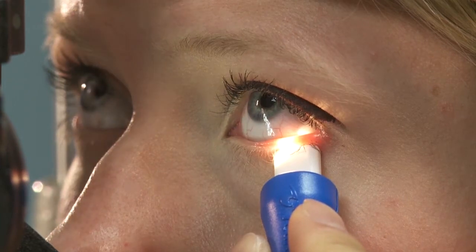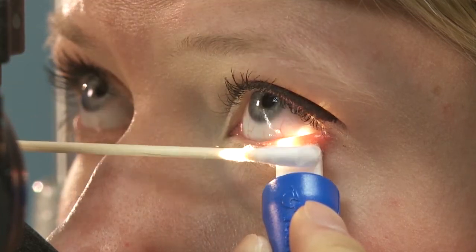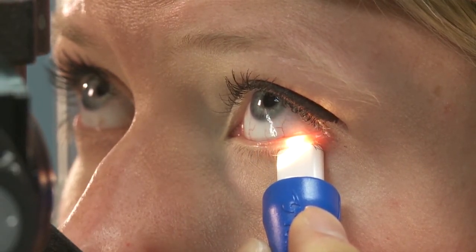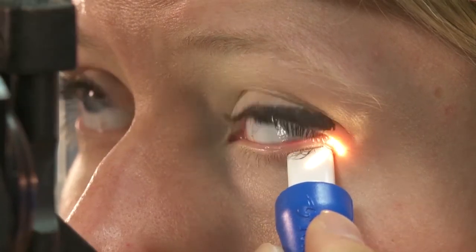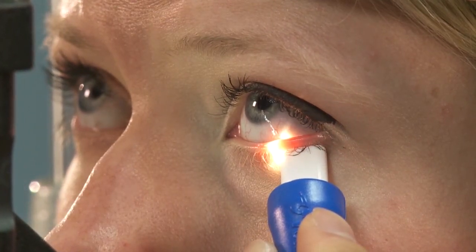Adjust the position of the MGE to roll the lower eyelid margin slightly outward for a clear view of the Meibomian gland orifices. To facilitate observation of the gland secretions, gently wipe the eyelid margin with a cotton swab immediately after applying pressure and while holding the instrument in position and maintaining pressure. Hold the instrument in place over the Meibomian glands for approximately 10 to 15 seconds.